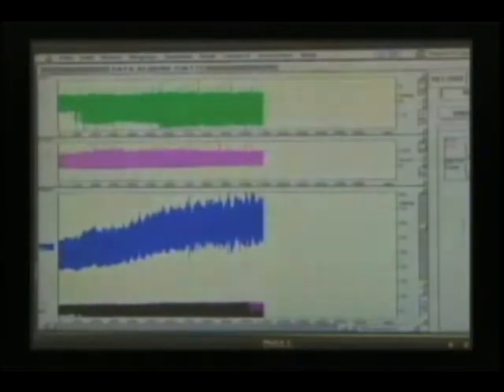17 minutes after application of the ResQGuard, you can see that the systolic blood pressure is now stabilized. We began with a systolic blood pressure before the ResQGuard was placed at approximately 40 millimeters of mercury. At this point in time, the ResQGuard was placed. You can see that the intrathoracic pressure begins to lower, and simultaneously the aortic pressure rises. 17 minutes later, the aortic pressure is approximately 80 millimeters of mercury over approximately 45 millimeters of mercury.